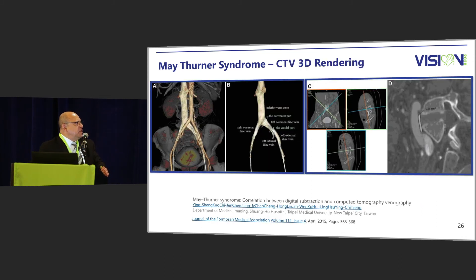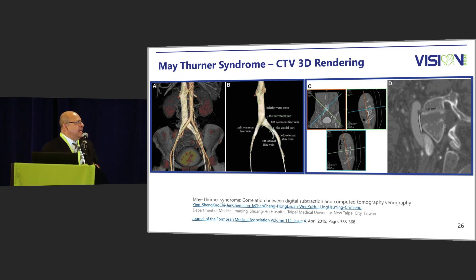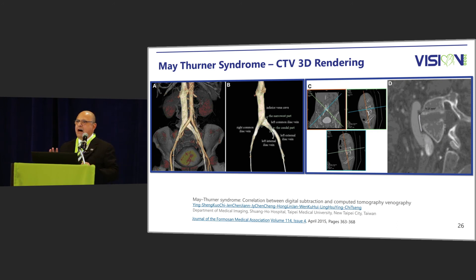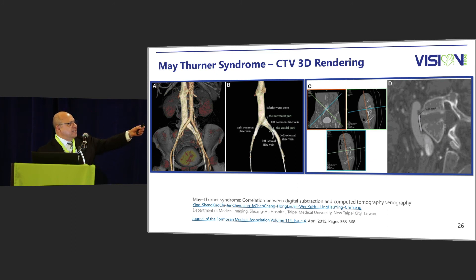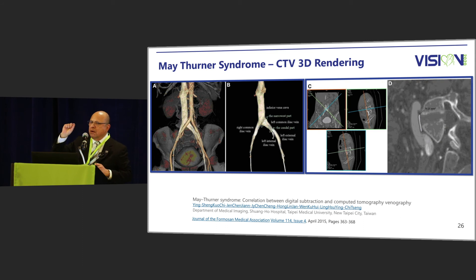This CT 3D rendering shows the artery and vein together; with software one can erase the aorta and iliac arteries, leaving only the vein and visualizing the indentation. IVUS is best for guidance, but with multiplanar reformation on the right-side image you can see the elliptical compressed vein — which is what one would see on IVUS.